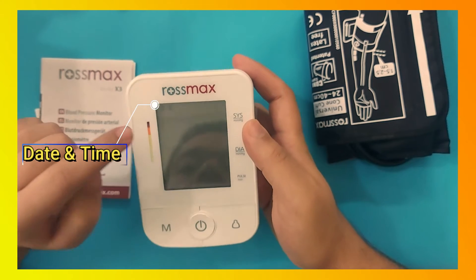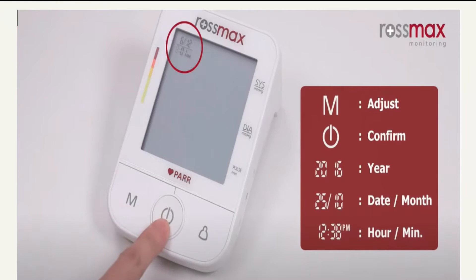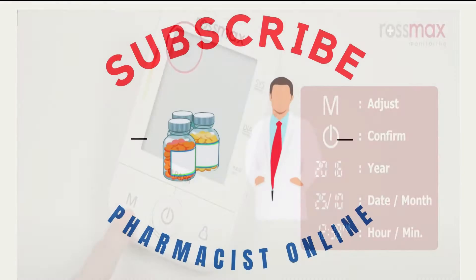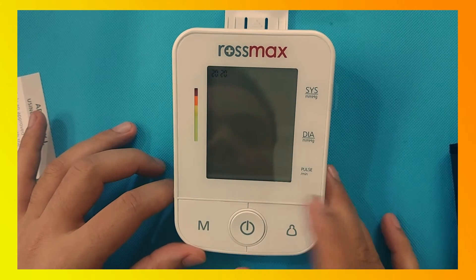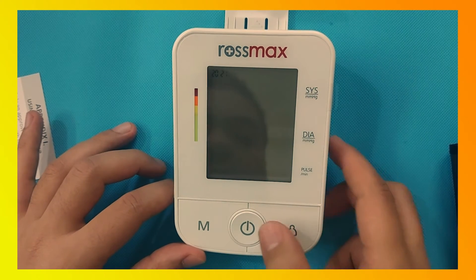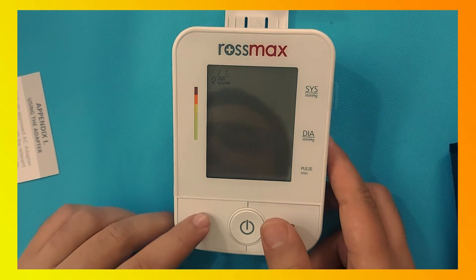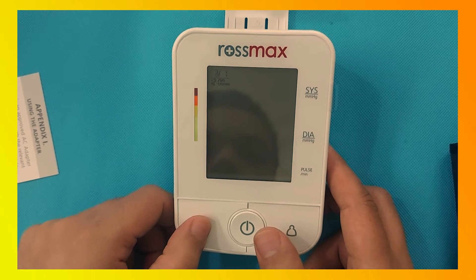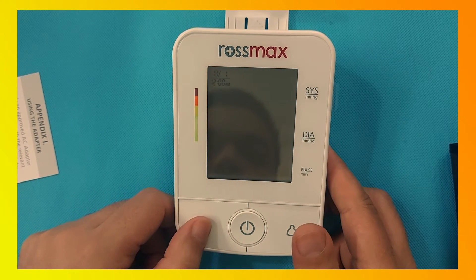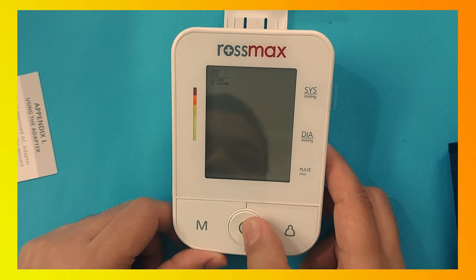As you can see, the year shown is 2018. Press the M button to increase the value to 2021, then press the power button to select this option. Now choose the month — increase it using the M button, and press the power button to confirm. As you can see, the month is now selected.